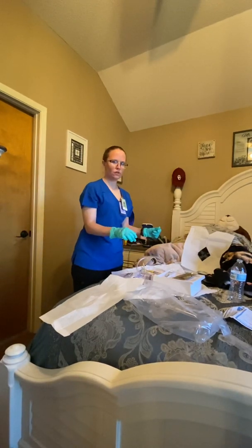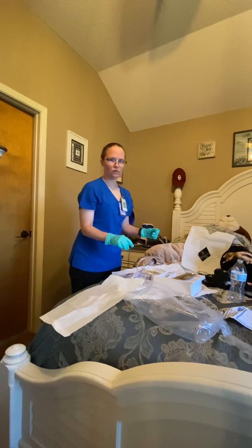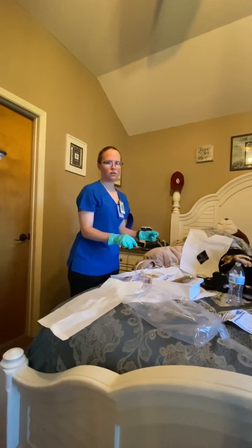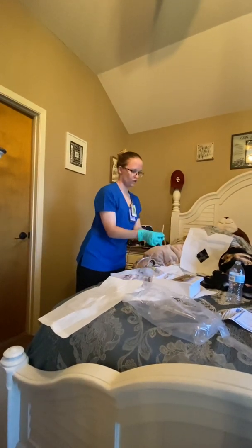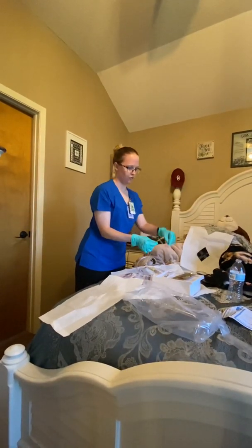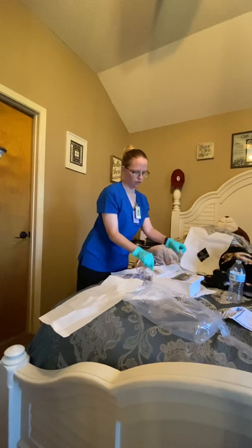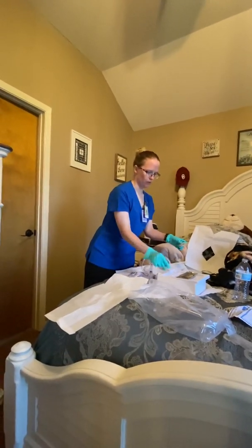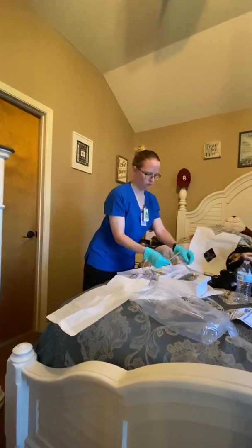Okay. Now, we're going to lubricate the catheter. For our females, it's about 2 to 3 inches, so we're going to act like there's lubricant here. In males, it's about 6 to 7 inches. Putting lubricant on the catheter. Okay.